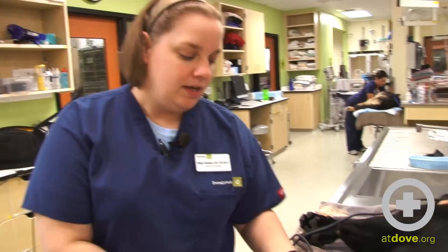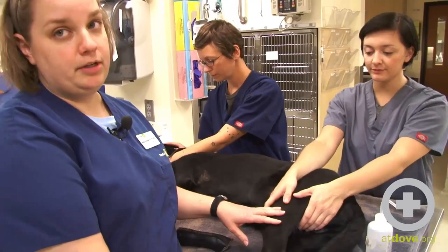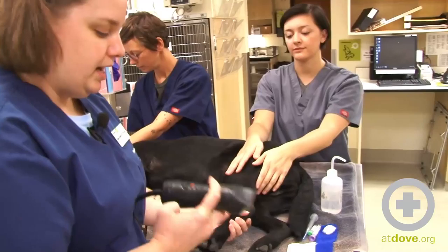Hi, I'm Megan. Today we're going to perform a blood draw from a lateral saphenous vein in a dog. Now in an emergency situation, we prefer to save the front legs and the cephalic veins for IV catheter placement. So when we give injections, especially a pain medication, or when we draw blood, we like to do it from these lateral saphenous veins.